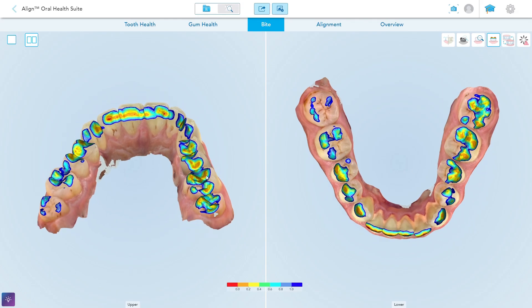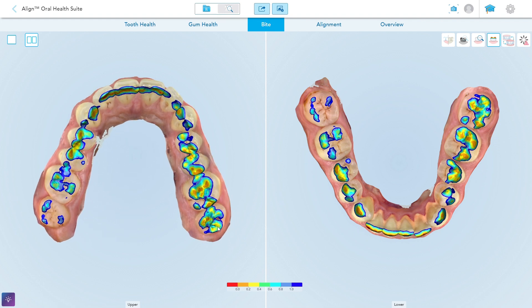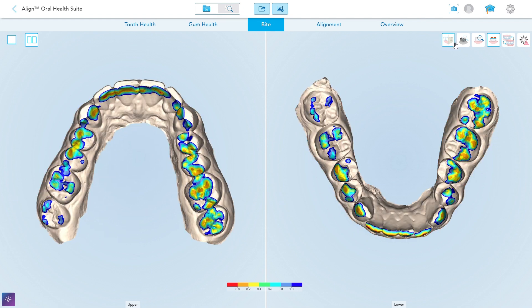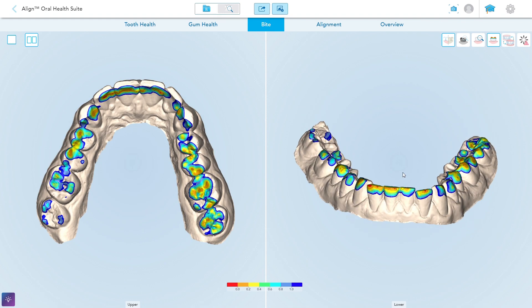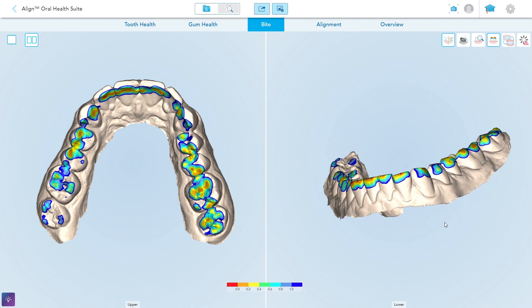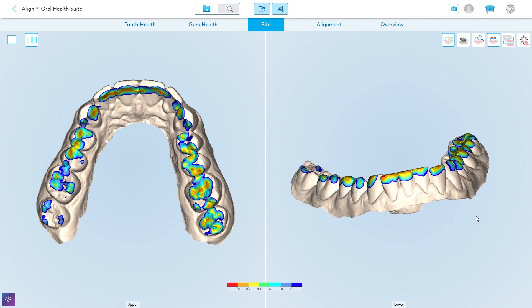Another tool in the Align Oral Health Suite is the occlusogram — or as I call it, the occlusal heat map — and that's because a range of rainbow colors showcases to you and the patient in real time where the high spots are in a patient's occlusion. We all know how complex occlusion is, and yet we also know that we have an overly simplistic tool to assess it. A piece of blue paper in a set of tweezers is just not good enough.